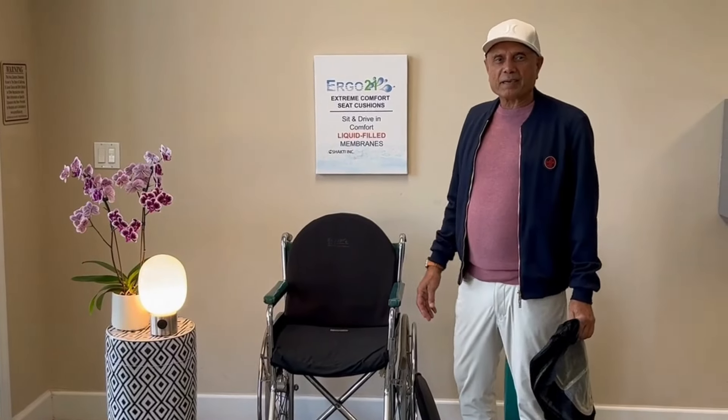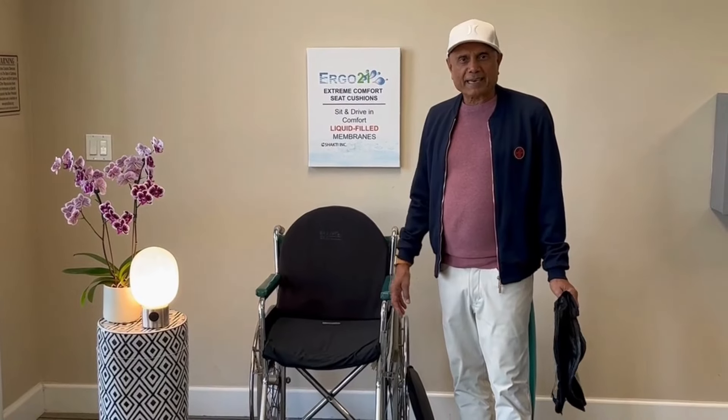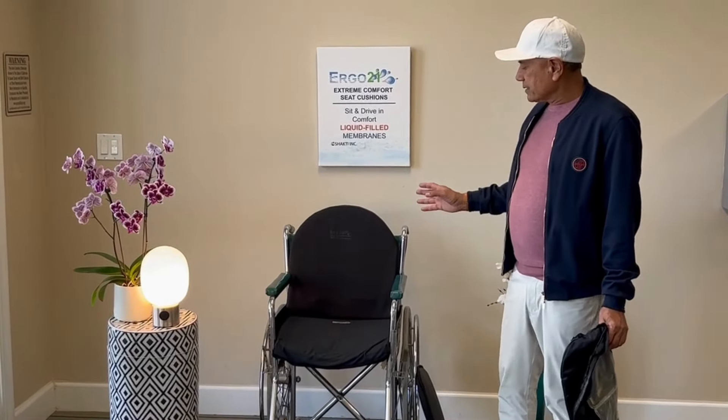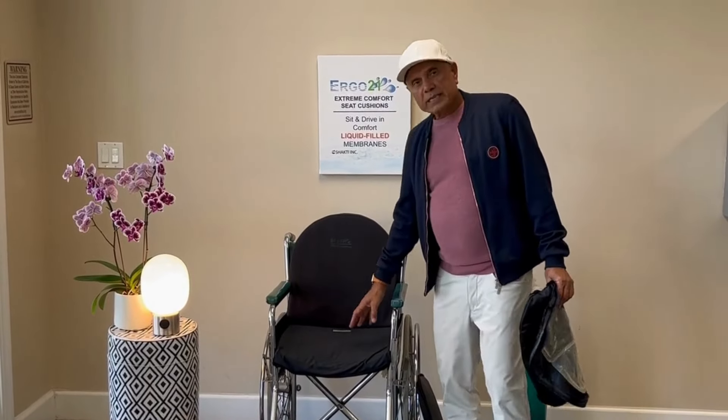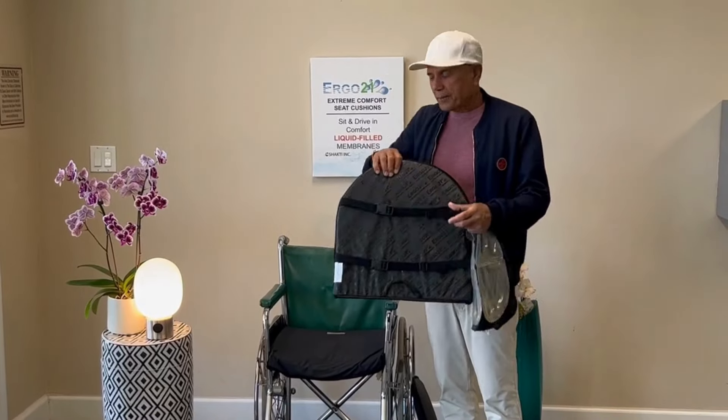Hello, this is Steve Gambhir with Ergo 21. I'm the product designer and specialist. Today I'll be demonstrating our wheelchair cushion with the lumbar support — it has straps in the back.